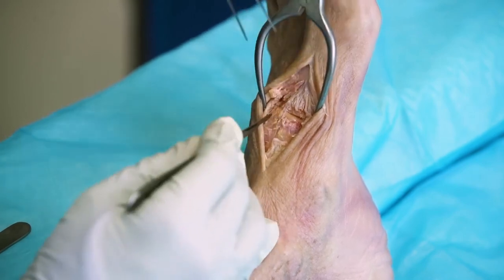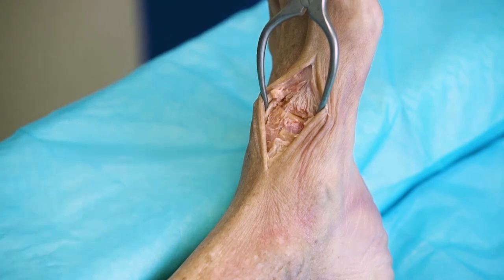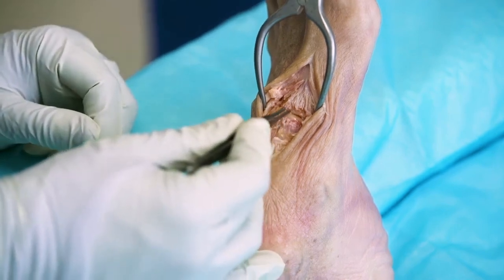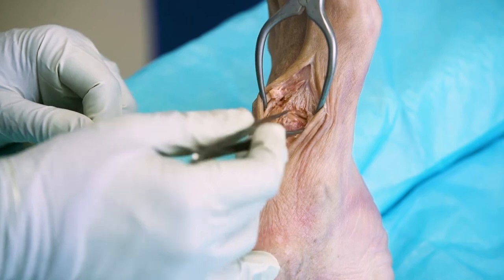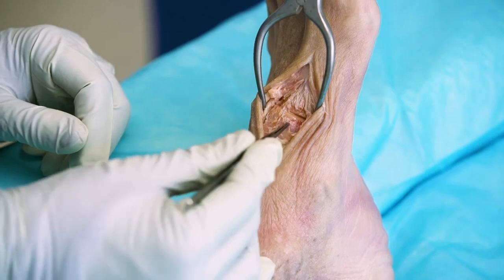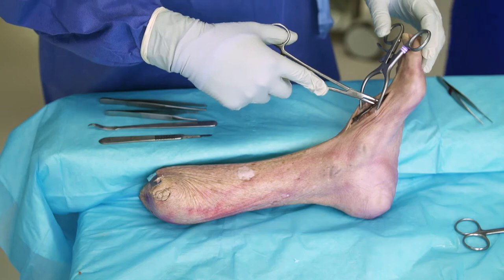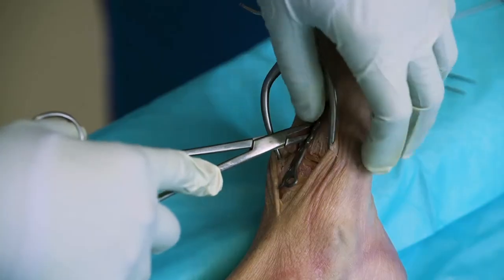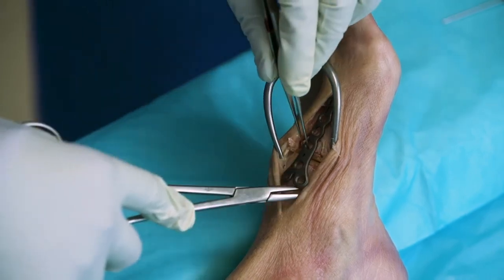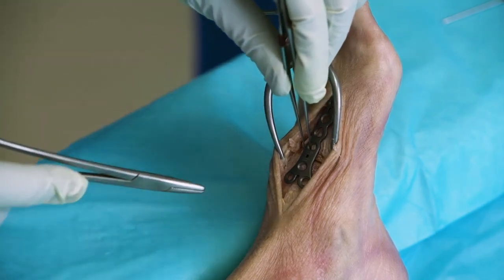Here's our joint. There are several reasons why you would approach it this way and then ultimately apply your fixation. For fusions, the next move would be to remove the cartilage and subchondral bone, which can be done with curettes and osteotomes or a saw blade. For fixation, we're going to leave the cartilage intact, and that's what we'll do here using the Stryker VaryX2 fracture plating system.